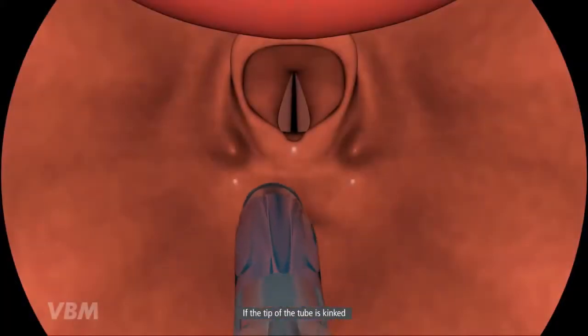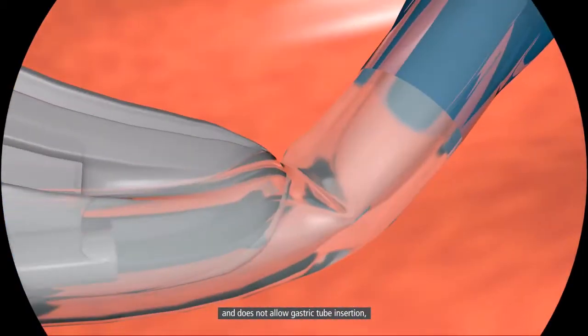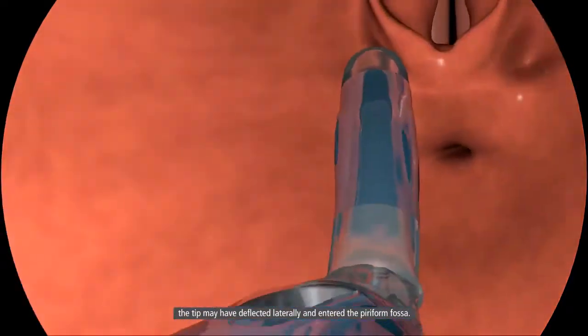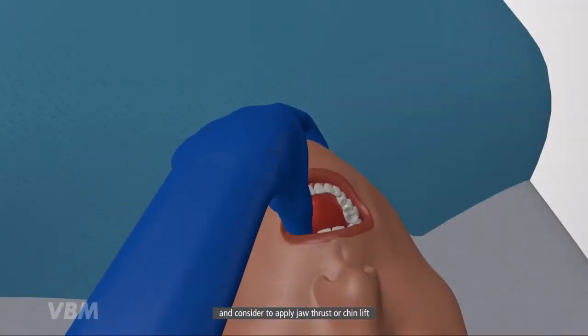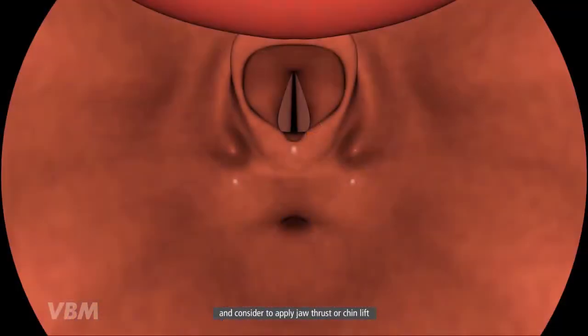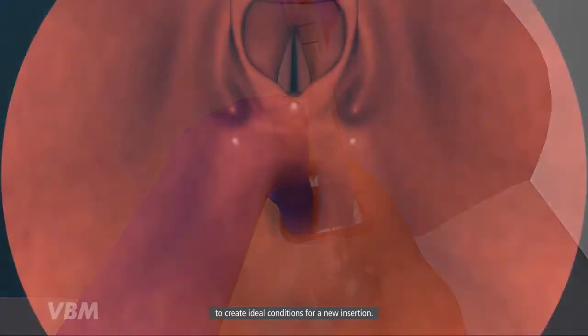If the tip of the tube is kinked and does not allow gastric tube insertion, the tip may have deflected laterally and entered the piriform fossa. In this case, remove the tube completely and consider applying jaw thrust or chin lift to create ideal conditions for a new insertion.